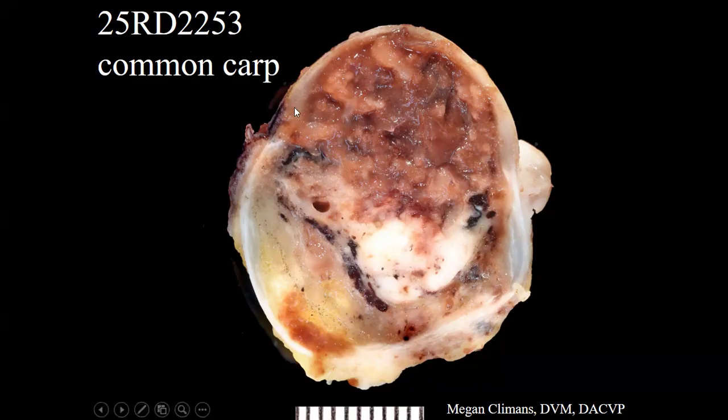We do have a cornea up here. You can kind of make it out. So here's one side of the limbus, here's the other side of the limbus. And the eye is essentially bulging with all of this soft tissue type material, sort of a semi-firm material, which kind of ranges from brown to like a white tan to like an orange yellow. You can just make out the choroid in this case.